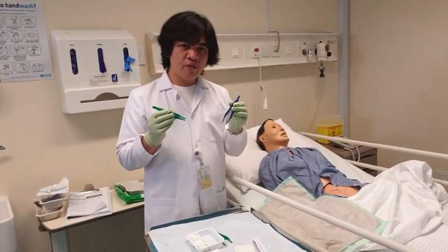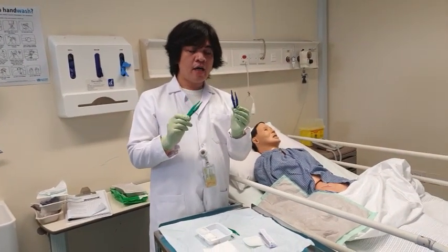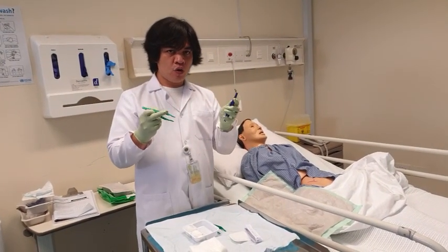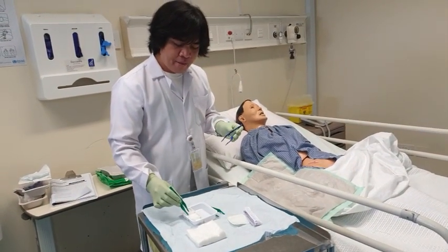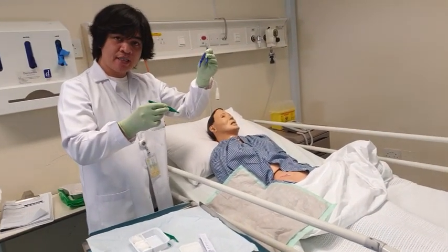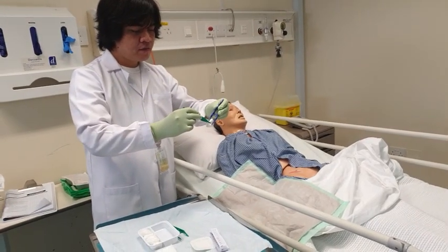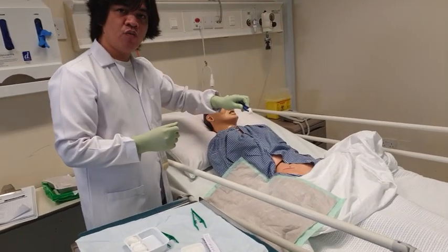Observe also the position of the forceps. This should not be held like this, or else you're going to contaminate your entire forceps. It should always be like this. Okay, so how do I start? Pick one gauze here and try to pass it to your blue forceps without touching each other. Like that. And now you can start cleaning the wound.